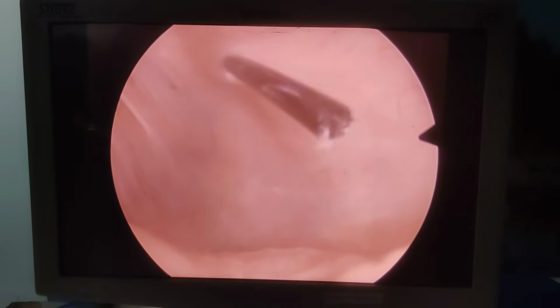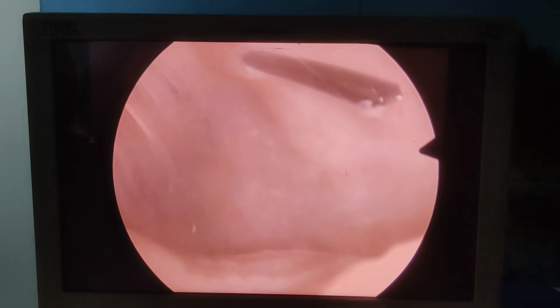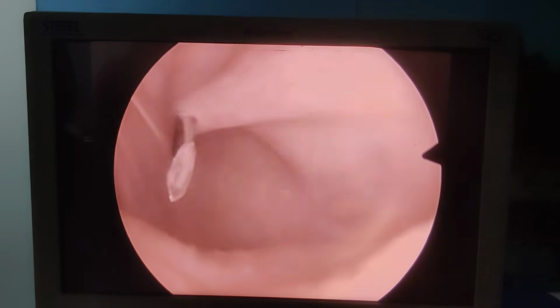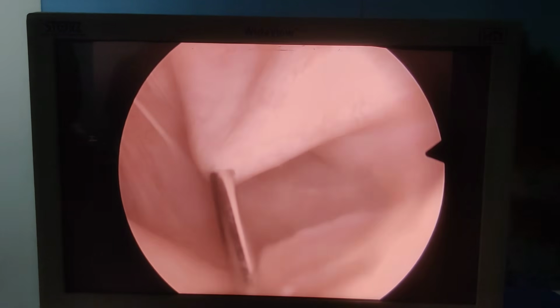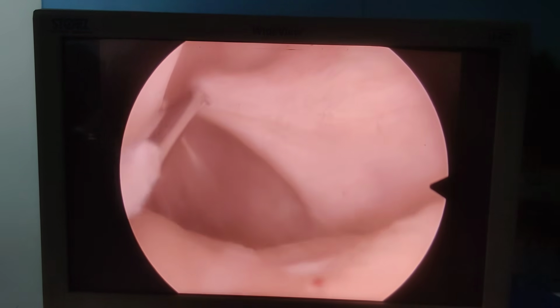So if you see my transillumination point, I have gone even 1 or 2 centimeter proximal to it, and I'll show you. And then I have come back. Now this is the back of the tibia. This is the back of the tibia. And now I want to have an access. Can you see this? This is the posterior condyle.